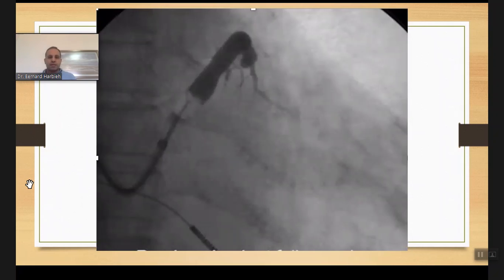So this is a case where you occlude the vein, the coronary sinus, and you look at this. Oh, this is a disaster. You know that you'll not be able to advance anything, but whenever you have this, you have two options. When you inject the balloon and you start doing the cine, just give it some time to see if there is any retrograde filling. Always, don't lose hope.